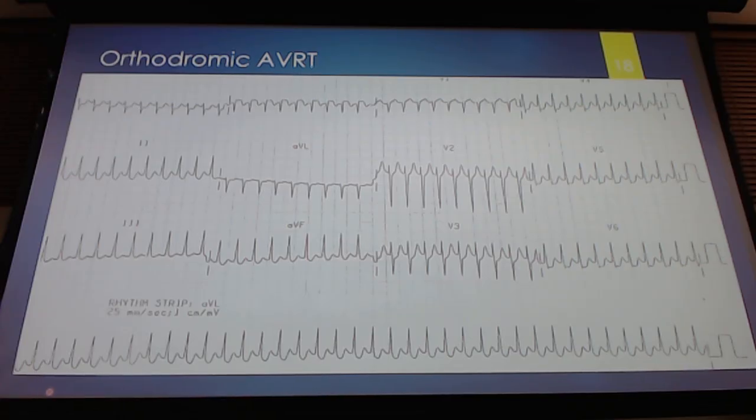So our normal rate, our normal millimeters per second is 25 millimeters per second where pen is on paper, right? We can go into the EKG machine and we can change this to something like 50 millimeters per second, and that will slow this down. And we do that all the time in the emergency department because these patients come in, and before we give them medication, we're like, wait, let's confirm. Is this actually a sinus tachycardia that's much faster than we would think? Or is this an SVT? Because the treatment is going to be different for sinus tachycardia and SVT.